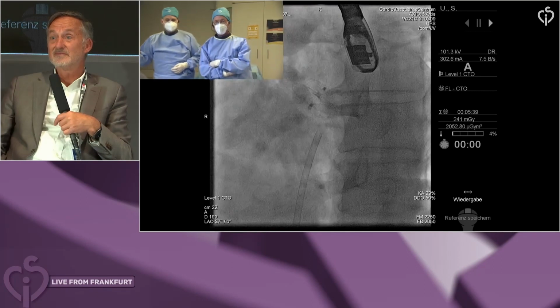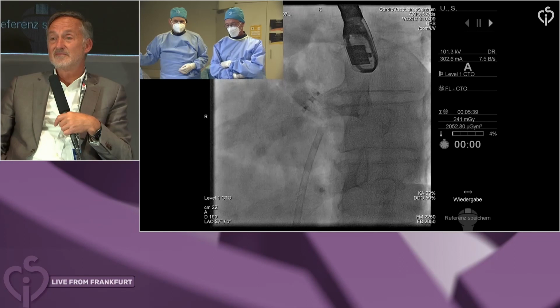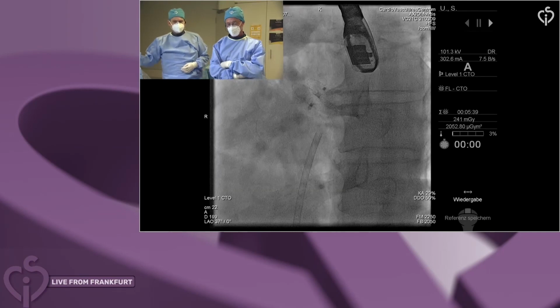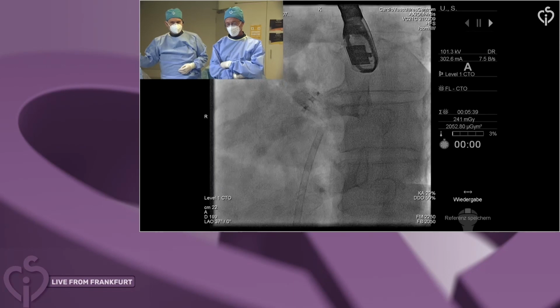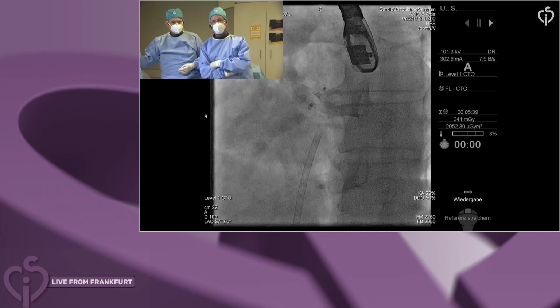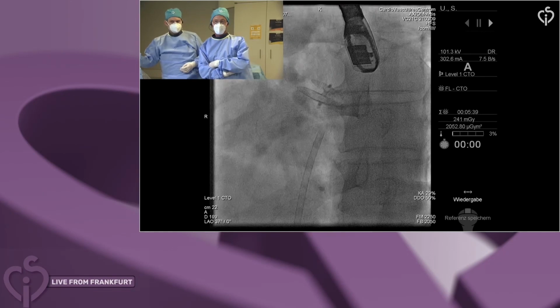New topic, Megan Coylwright. I'm interested in the panel and Horst's thoughts. When you have choices, and it's a straightforward anatomy for a 25, how do we think about setting the patient up for success decades later for potential access to the left atrium? It's one reason why I try to choose the smallest device possible, so I have room in the posterior septum. But does it also influence the type of device you choose?